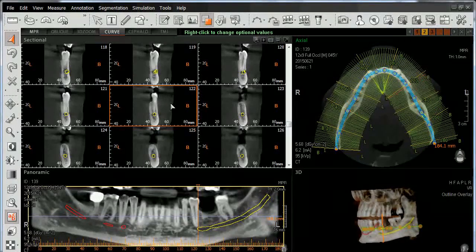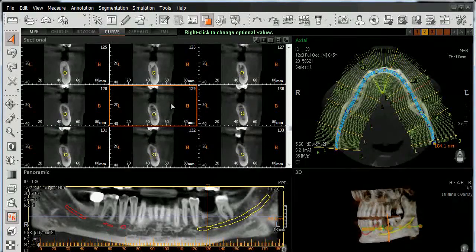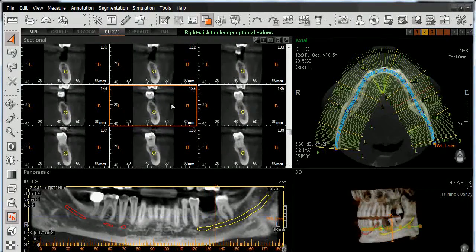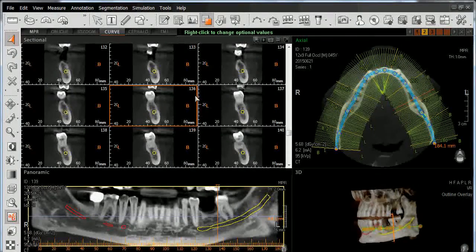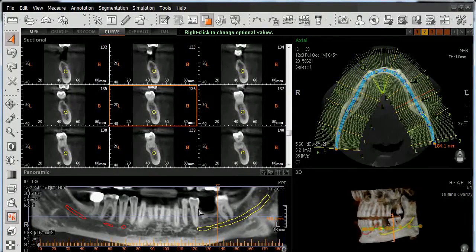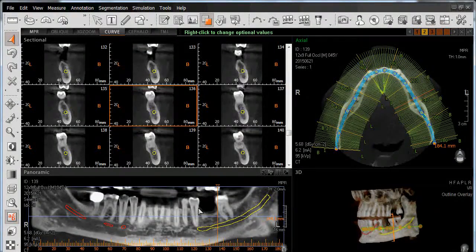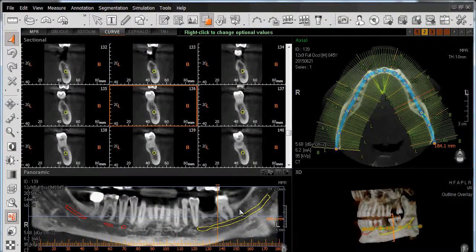If we scroll with our center mouse wheel until we get to the mesial edge of our premolar, we'll see we're now at section number 136, which gives us a 14 millimeter distance between the distal edge of our second premolar and the mesial root of our second molar.